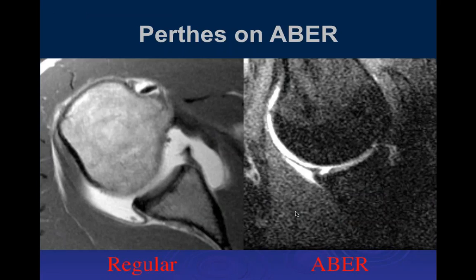Is this really an ABER or a hyperflexion and external rotation? Well, I don't think it's flexed because it's up over the shoulder, John. Well, you can flex the arm forward and go straight up to 90 degrees, and then externally rotate the arm. So you do not have to abduct the arm. Abduction of the arm is quite different. It's away from the body. And I don't think anybody, especially with a sore shoulder, can abduct the arm.